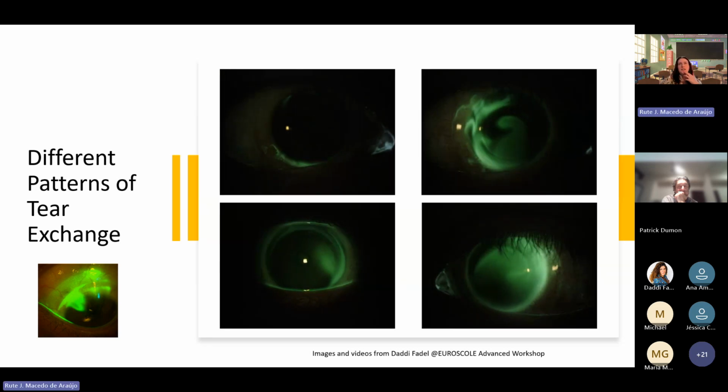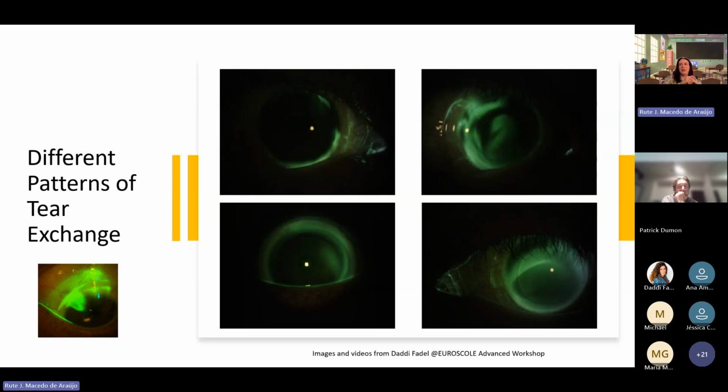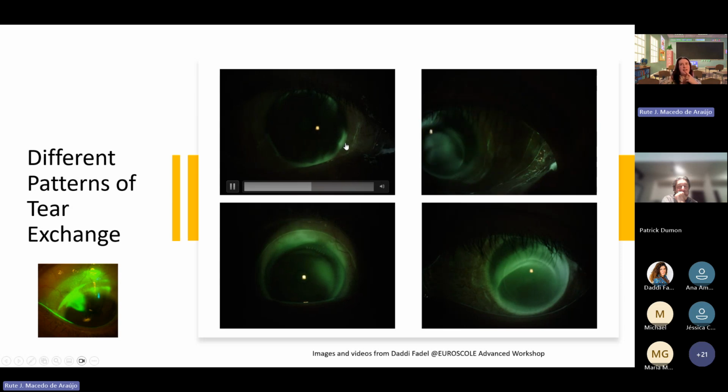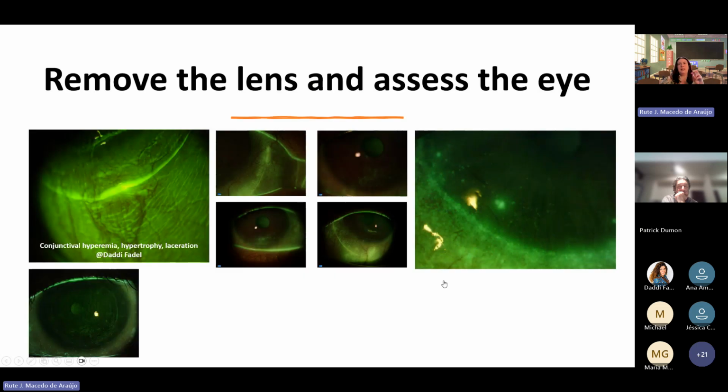And there are different patterns of tear exchange that we can see if we put fluorescein over the lens. In some cases, the lens is too tight, so the fluorescein will not enter. In other cases, the fluorescein will enter very easily. And of course, as I told you, even when you have some difficulty in assessing the fitting of the lens on the eye, please remove the lens and assess the eye with fluorescein on the slit lamp, and it will tell you everything that is happening underneath the lens.